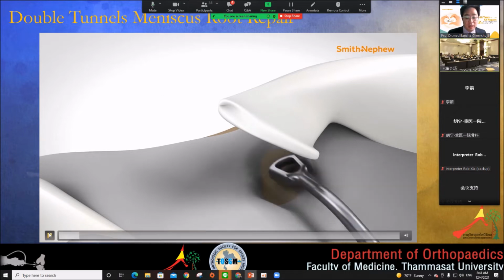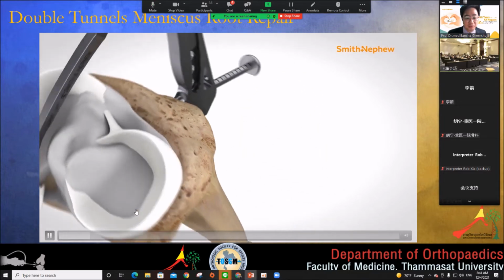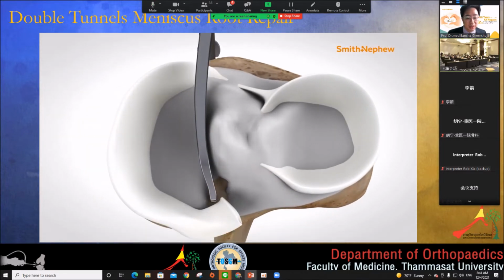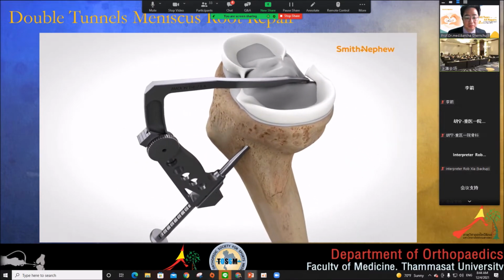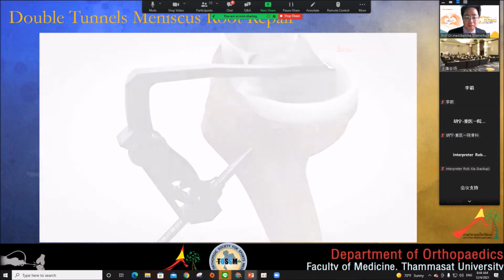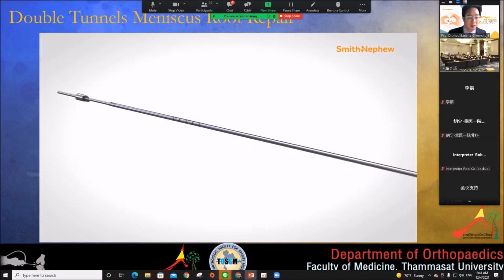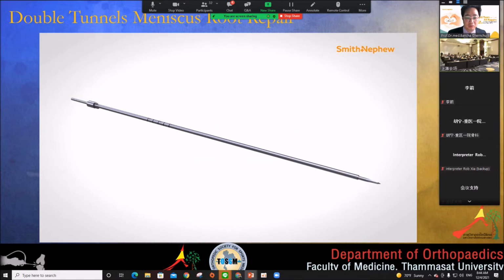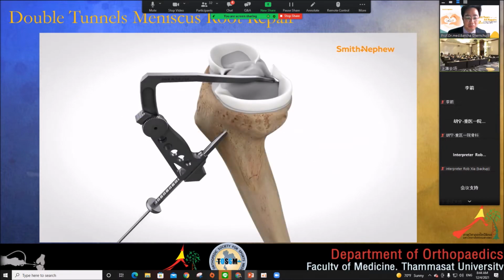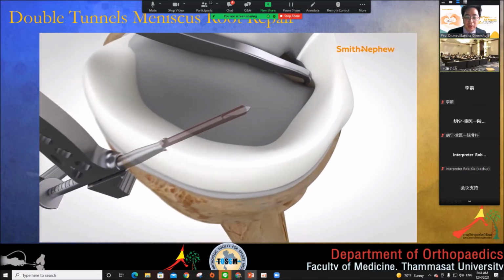Make it arthroscopic and then make a good raw surface. Fixate the tip aimer where the most posterior tunnel will be placed. Make a tunnel. And align the bullet externally on the tibia, just medial to the tibial tuberosity. Affix the cannula to the drill. And drill up through the bullet until the drill breaks through the surface of the tibial plateau.